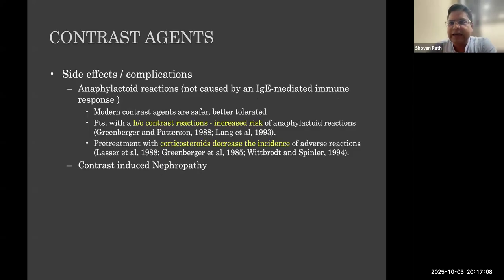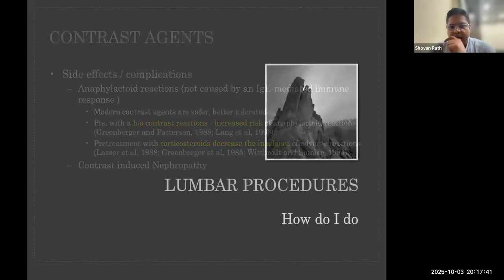Before using this kind of fluoroscopy and the dye, you must take a history of any allergic reactions to it, and you must be ready with corticosteroids and other rescue equipment before any contrast injection. This is mandatory in all fields, not only in this one, but anywhere you use any kind of dye, as there can be a dye-induced reaction, an anaphylactic reaction. So you must be cautious whenever using a contrast agent.